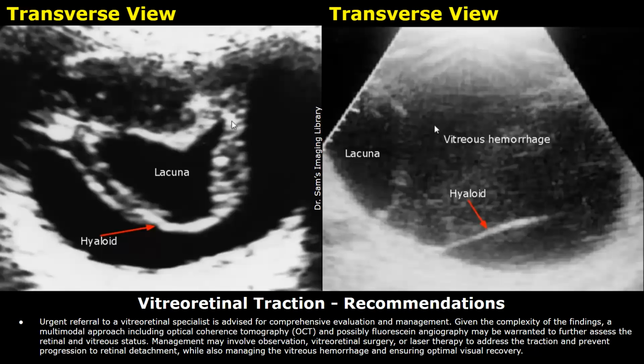In the recommendations, you can advise referral to an ophthalmologist. OCT and fluorescein angiography can be advised as well.